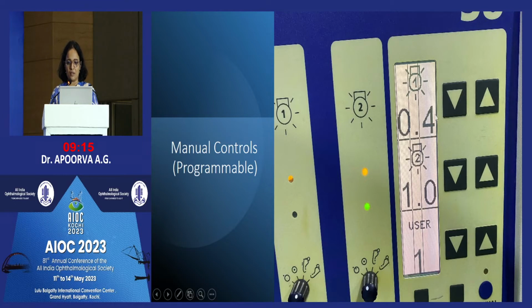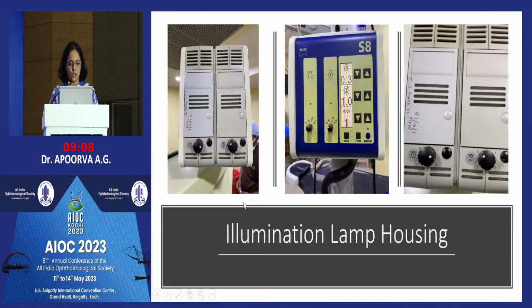These are the illumination of the lamps, which can be programmable. So this, like I was saying, is the illumination lamp housing. This can house two lamps.